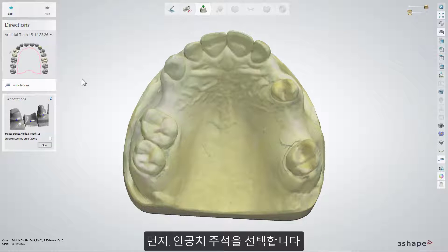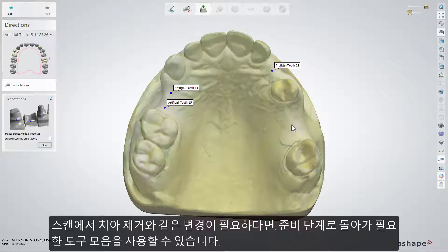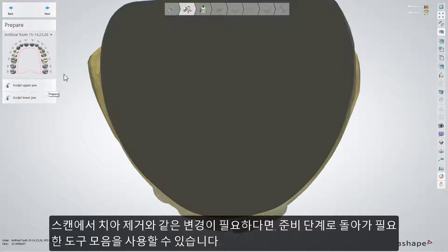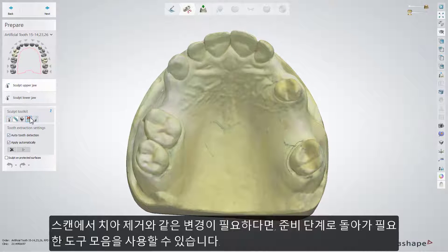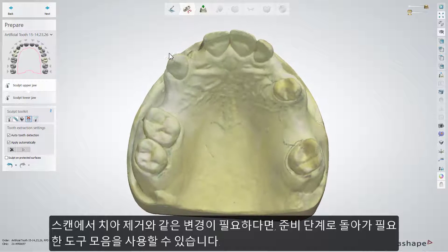Firstly, select the annotations for the artificial teeth. If any adjustments of the scans are necessary, for example tooth removal, you can move back to the prepare step to use its toolkit.